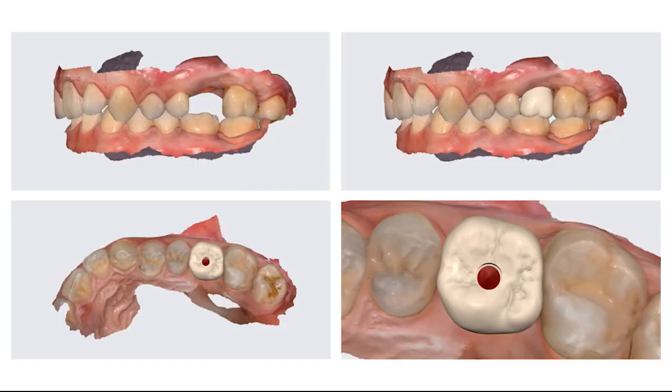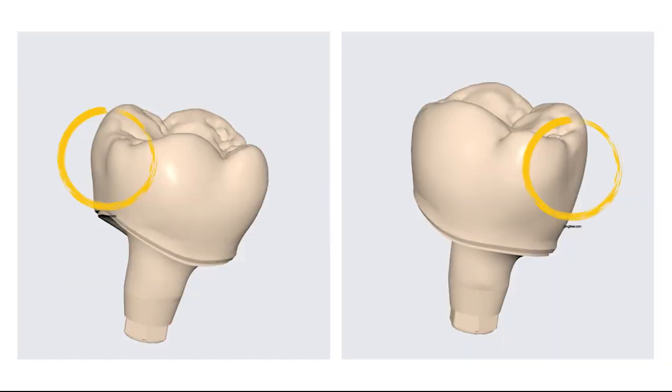This is the crown case for implant number 26. Note the shape of the contact point with number 25. If you look at the actual design, you'll see that the mesial-adjacent faces are overfilled lingually.